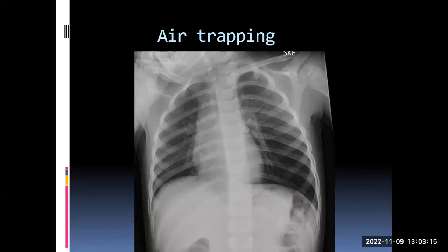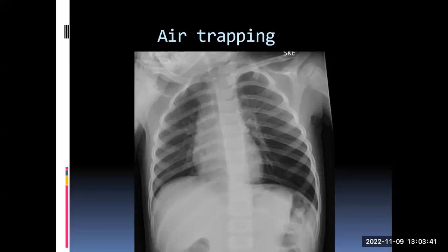Air trapping is usually in children due to aspiration or foreign body. What happens is the foreign body acts like a one-way valve: during inspiration the bronchus expands slightly and there is a little space around the foreign body allowing air in, but during exhalation the intrathoracic pressure increases, reducing that space, so air gets trapped. You see a more expanded and more translucent — darker — lung on the affected side. If the patient is nicely positioned and the film is non-rotated, you can safely say there is air trapping. A rotated film can give a false sense of air trapping.